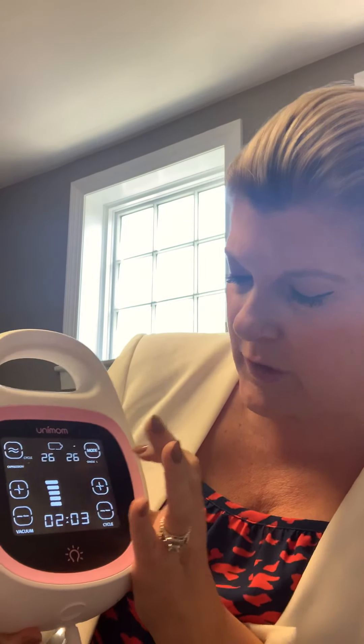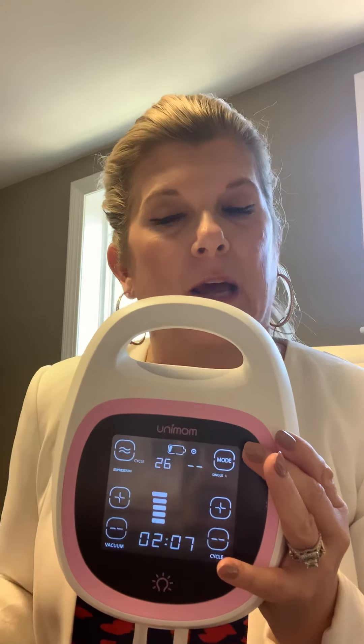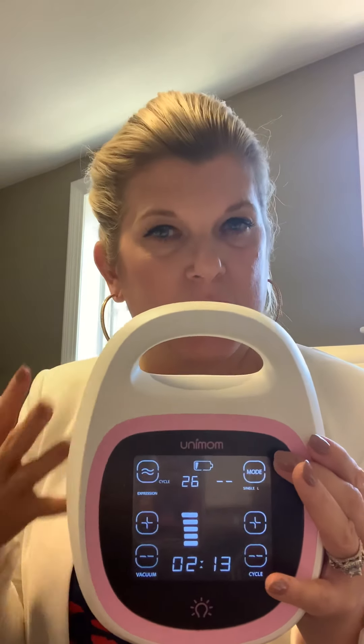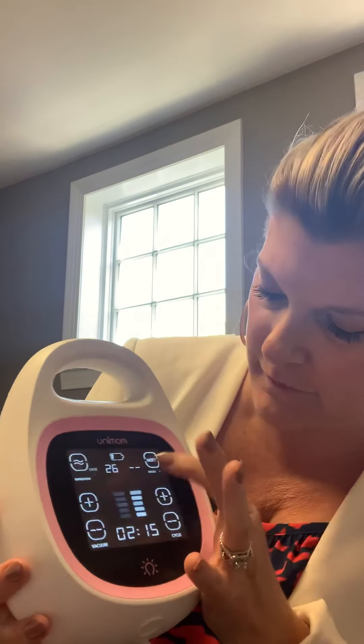You can do alternate mode, which means you get suction on one side and then suction on the other side — it's a comfort thing. Or you can do a single side. Say you have one side that empties first and you don't want the other side to continue — you can just turn off one side, which is a really nice comfort feature.